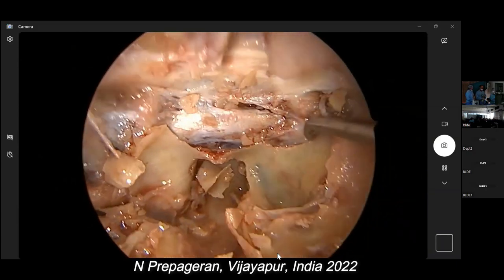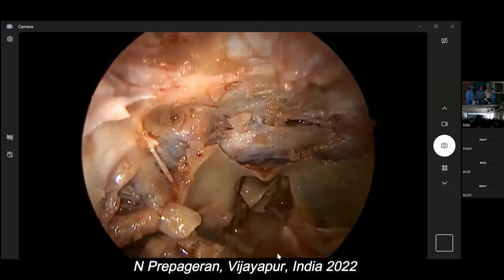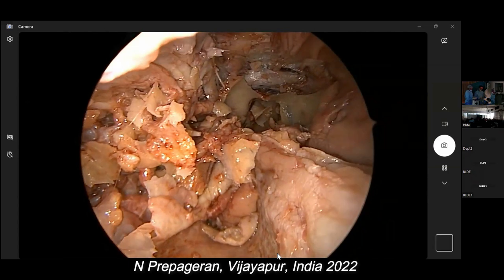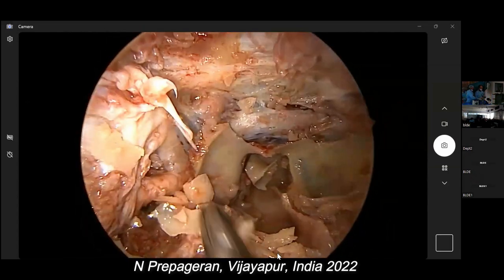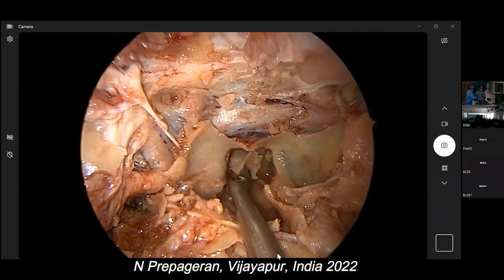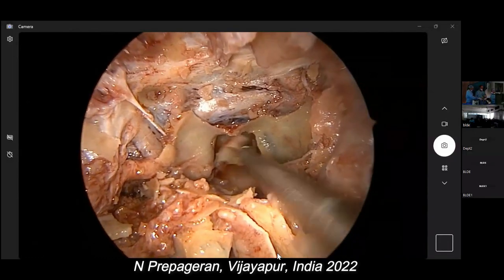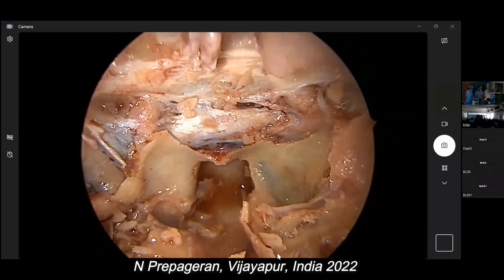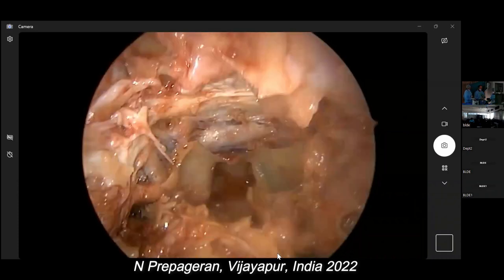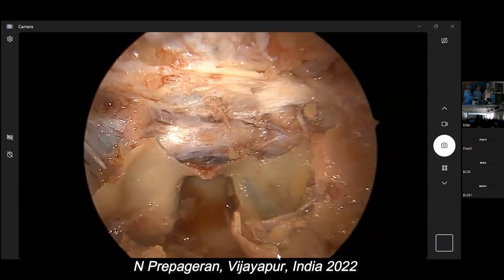Good. I think we should be okay. Is that enough for the cavernous sinus here? Yes, it's enough for the cavernous sinus here. And this is the opticocarotid. Give me a Blakesley for that. Let's take out all the bone pieces. Just give me one minute, guys. I'll take out all the bone pieces before we open up, yeah? Okay, now remove all the bone. Now you can see the planum very nicely. Let's look at the skull base now, before we open.